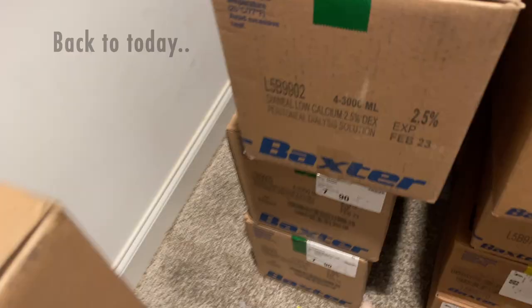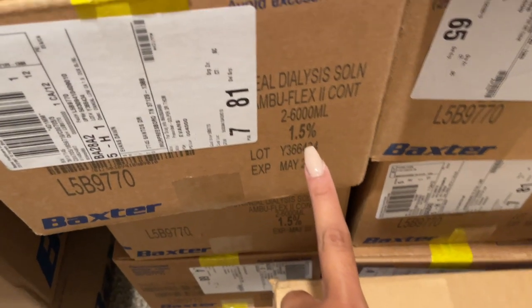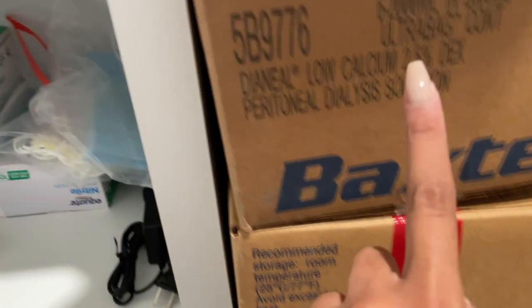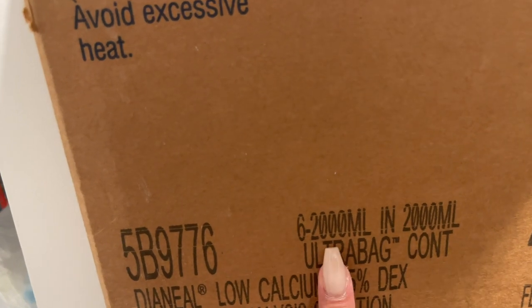This is my dialysis equipment closet in the new house. The boxes are labeled — four three-thousand milliliter boxes, two six-thousand milliliter boxes, and for the manual it'll be six two-thousand milliliter boxes. Manuals are always two thousand milliliters. Today I'll be using a green manual dialysis bag.